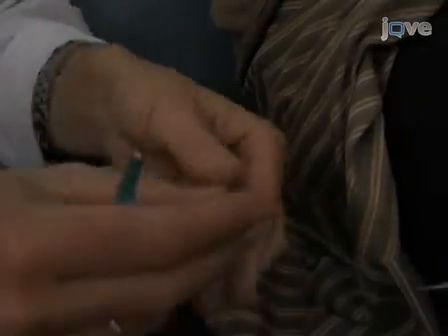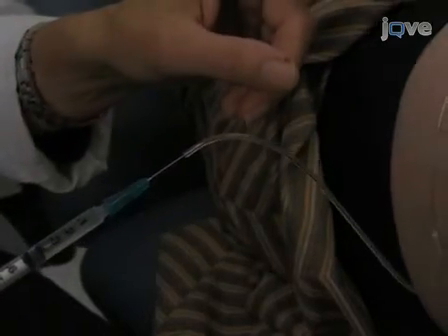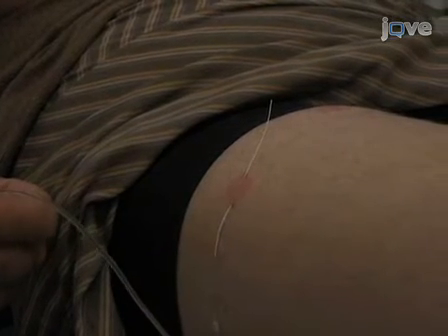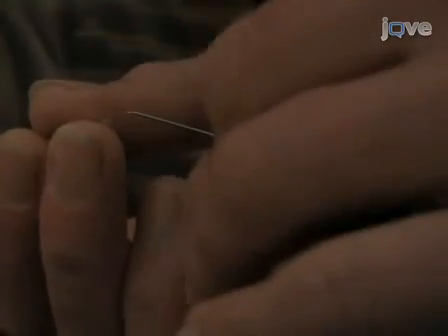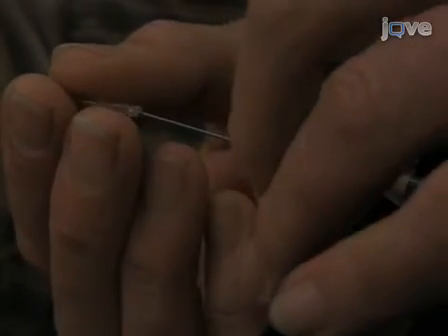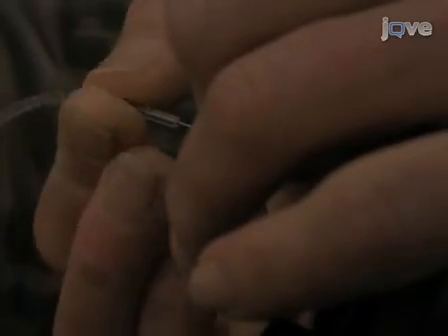To begin the sample collection, first flush the catheters with 1% albumin-enriched Ringer's lactate solution. This is done by carefully inserting a syringe with a 23-gauge needle into the distal end of the microdialysis catheter and slowly injecting solution. Flush the catheter until you see droplets along the length of the catheter as well as at its tip. After flushing the catheter, attach the distal end of the catheter to the tip of the 23-gauge needle of the syringe that is resting in the rack of the infusion pump. Avoid puncturing the needle through the wall of the catheter, which would cause potential leakage.